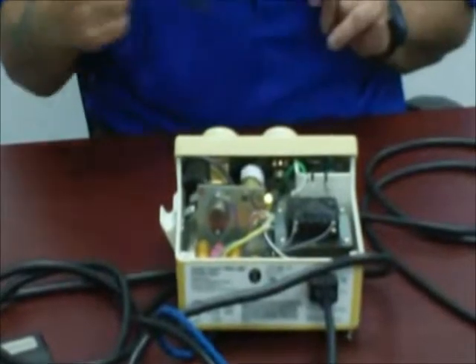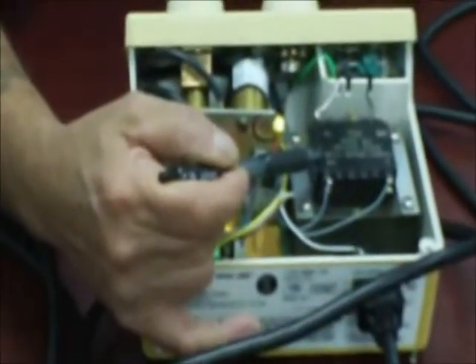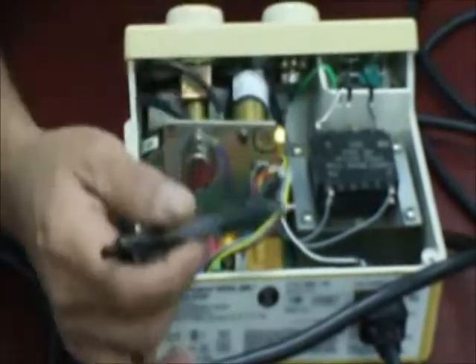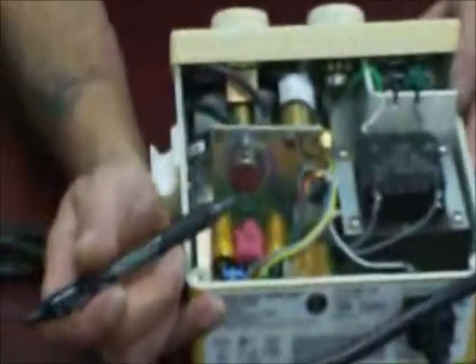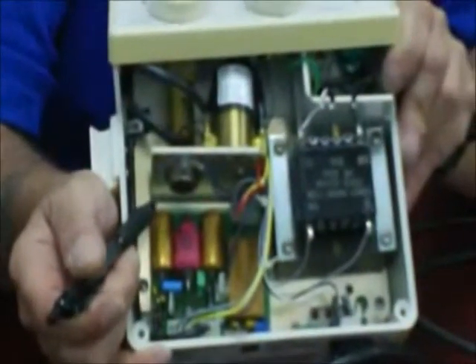Internally, we have a few components, including some field replaceable ones. We have a transformer — a very simple transformer: 110 to 115 primary in, 24 volts secondary out, which supplies 24 volts to your main circuit board. That circuit board is the heart, brains, lungs — everything — of the cavitron.